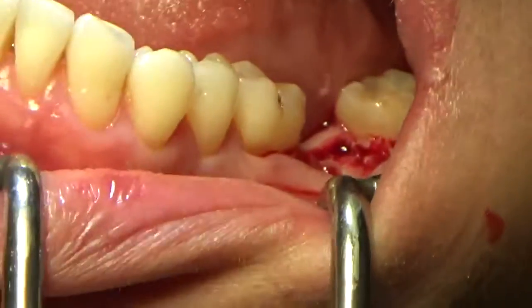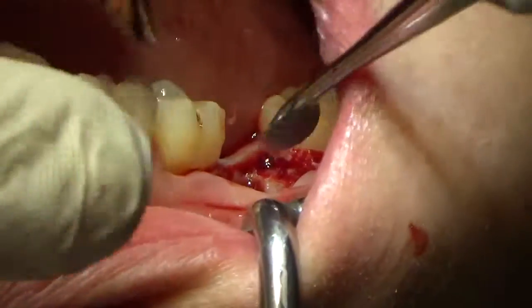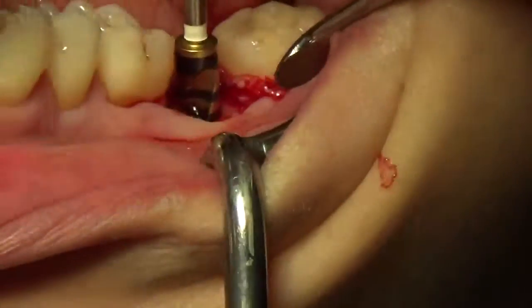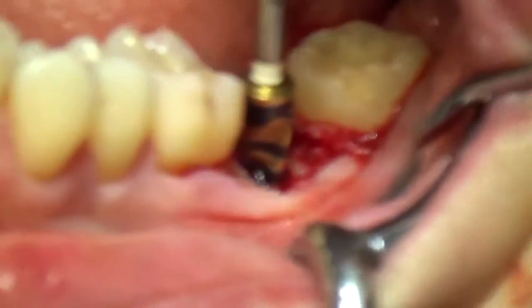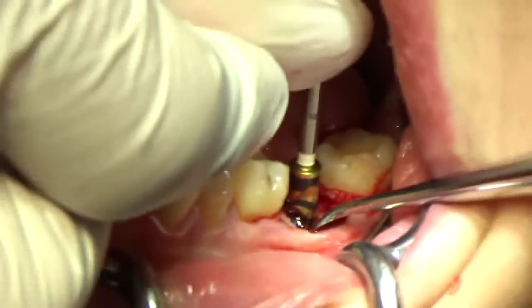I'm going to take the shorter drill and we're just going to look. I'm going to put it straight into the osteotomy and we're going to look. So if I put that drill straight into the osteotomy, what can we see? What can we tell? Well, we can tell that I like the buccolingual angulation. The mesiodistal angulation is nice as well.